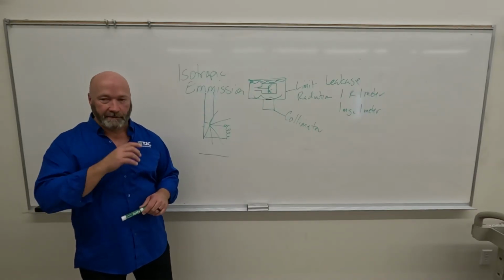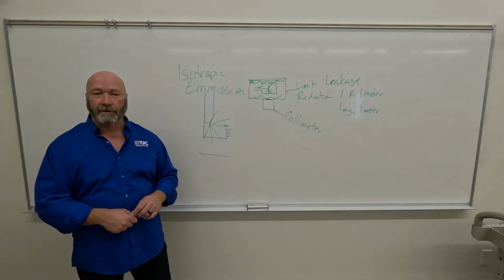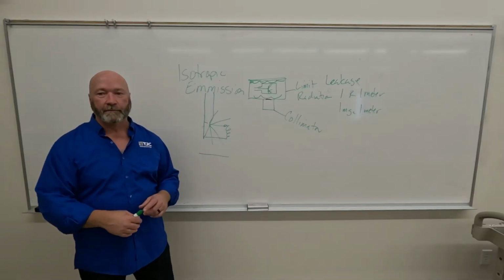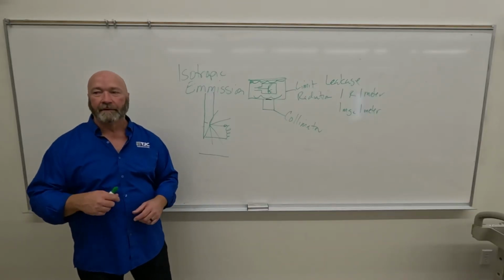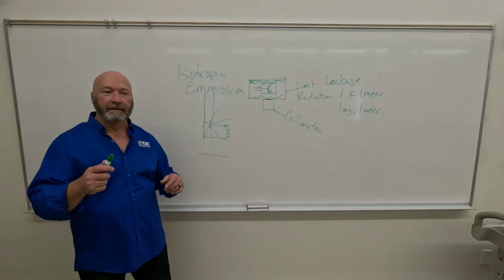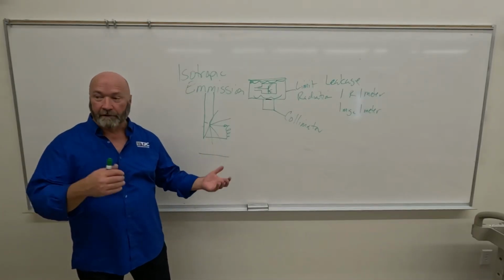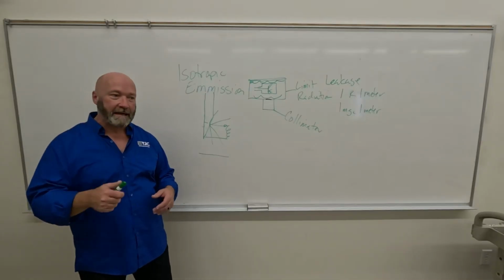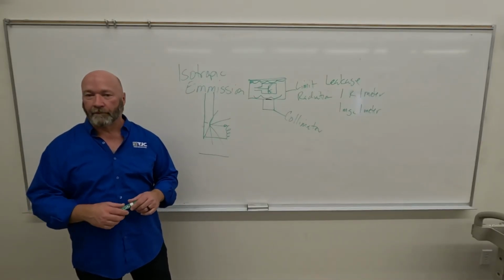Erratic exposures. Okay, so you walk into the X-ray room one day, you make an exposure, and you get a perfect exposure. You set a foot technique and you get exactly the index number that you should have gotten. Then you go back in tomorrow, let's say we're doing a follow-up on the same patient, you use exactly the same technique and your index number is half of what it was before.